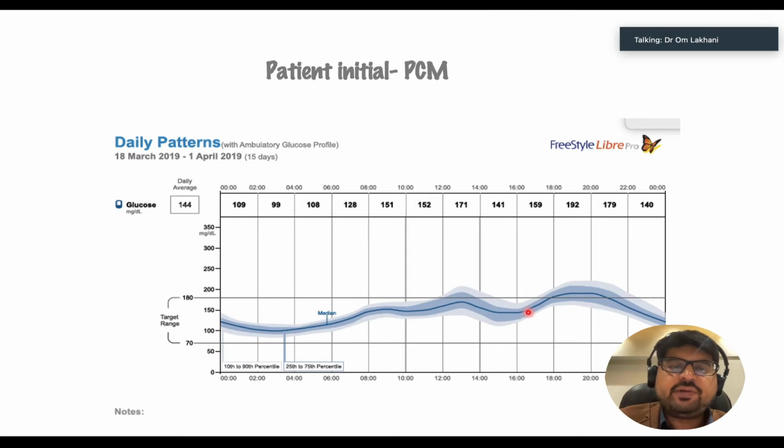So you can see overall the patient is doing reasonably good. There is less glycemic variability in terms of intraday as well as interday variability. However, we did realize that the patient has a post-evening snack rise, so there is a pre-dinner surge in glucose.